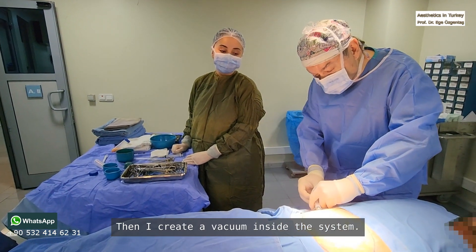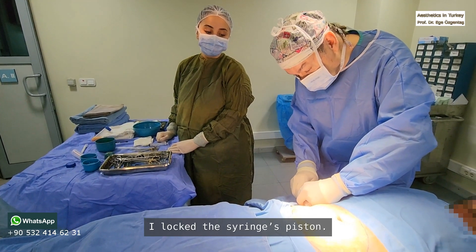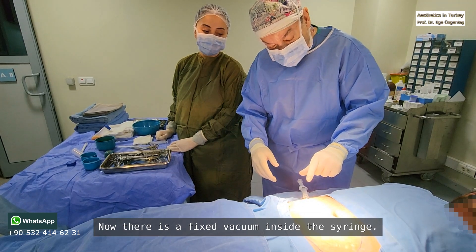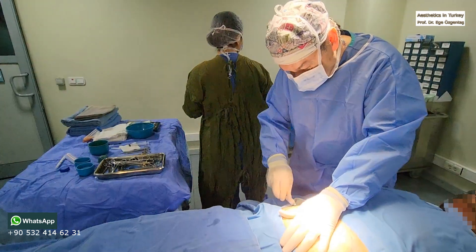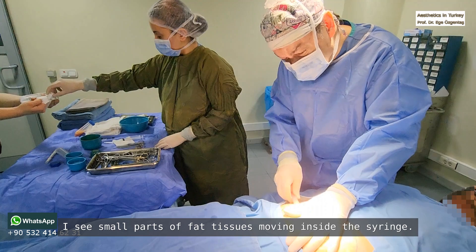Then I create a vacuum inside the system. I lock the syringe's piston. Now there is a fixed vacuum inside the syringe. I will suck the fat with the help of this vacuum. I can see small parts of fat tissue moving inside the syringe.